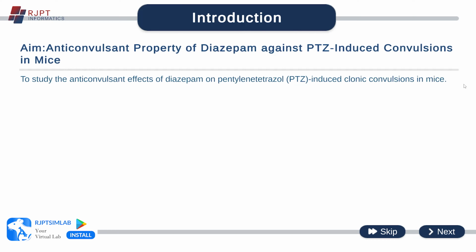In this video, we will study the anticonvulsant property of diazepam against PTZ-induced convulsions in mice. At the end of this video, we will be able to tell about the anticonvulsant effects of the diazepam drug on pentylenetetrazole-induced clonic convulsions in mice. Now, let us start with the video.